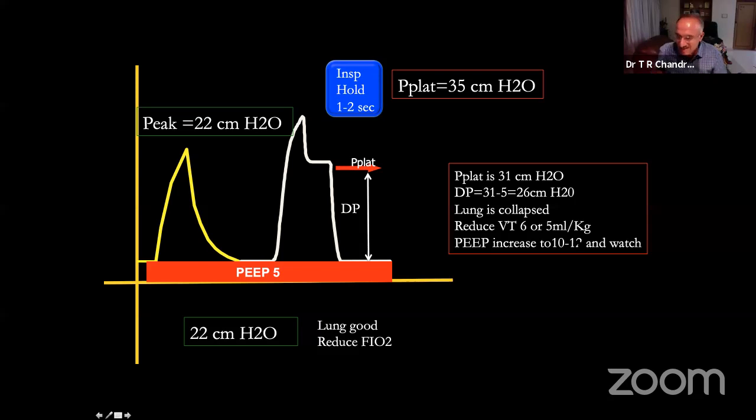Yesterday, somebody was asking a question. How often do I change PEEP? How do I do a plateau pressure? I wait for 5 minutes after a change in volume or a change in the PEEP or tidal volume, then do a plateau.